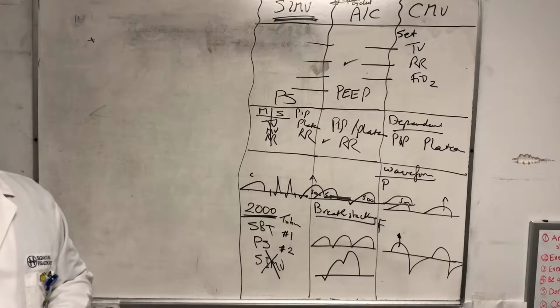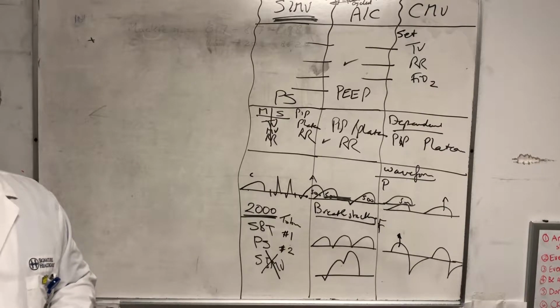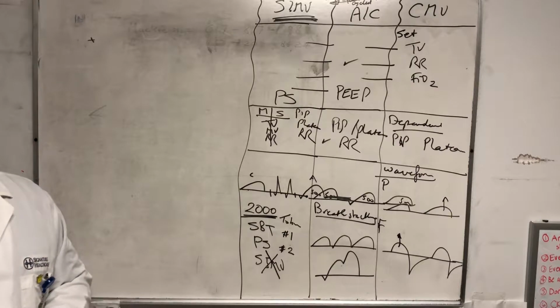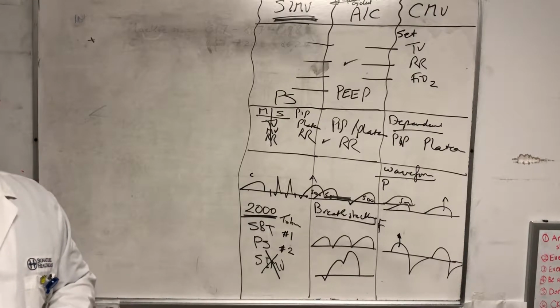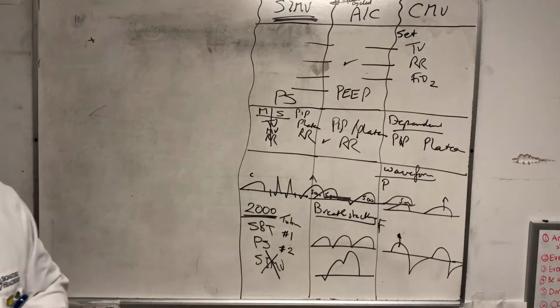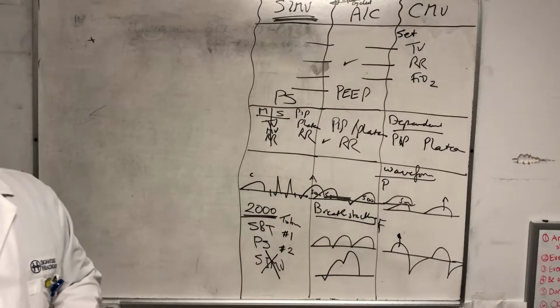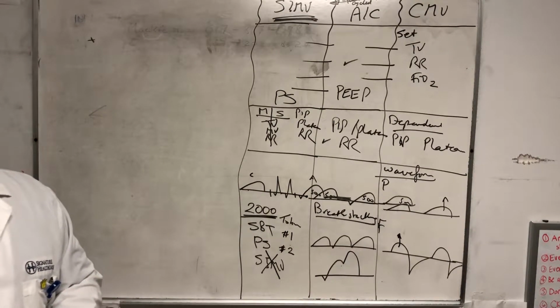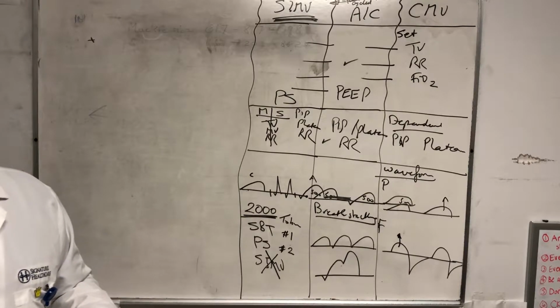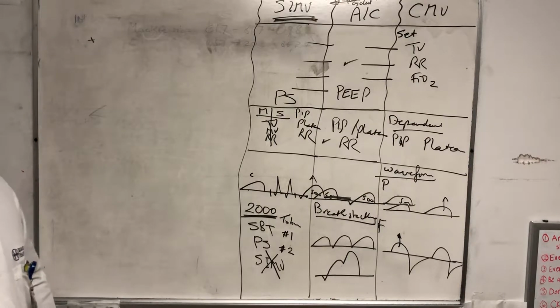I'll tell you about the most famous study, in which they put three things against each other: physician-driven weaning versus respiratory therapist-driven weaning versus protocol-driven weaning, right? Do you have any guess? Physician's worse. Yeah, the protocol-driven weaning was the best, followed by respiratory therapist-driven weaning, and then the physician-driven weaning was the worst, because only every few days you change the vent one time or something, right?